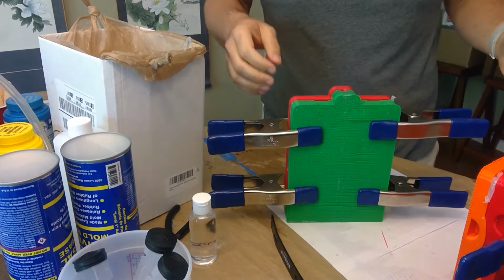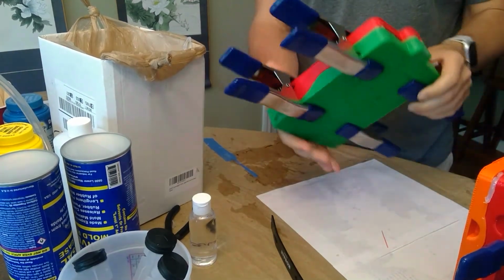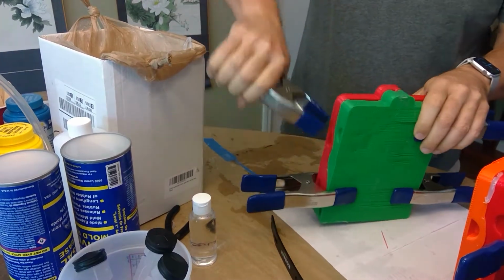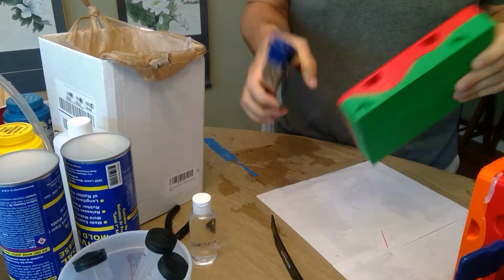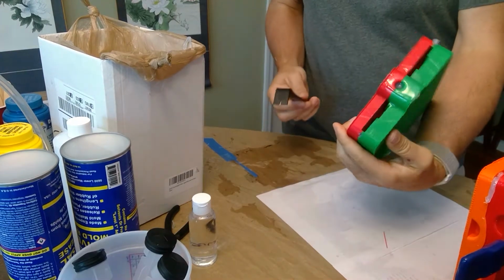Okay, we're going to do a video for the version 6 gasket mold and how to take that apart and clean a mold. So first you take off your four clamps. Then you're left with your mold.